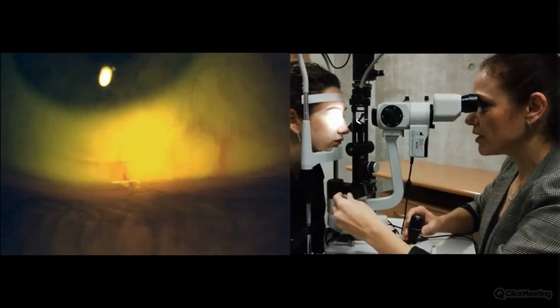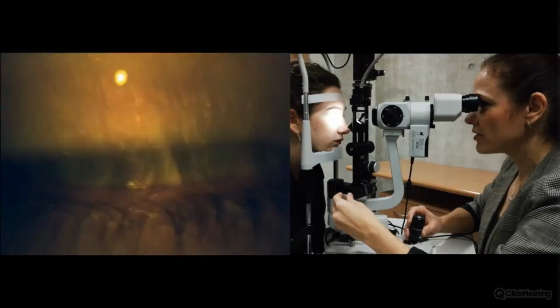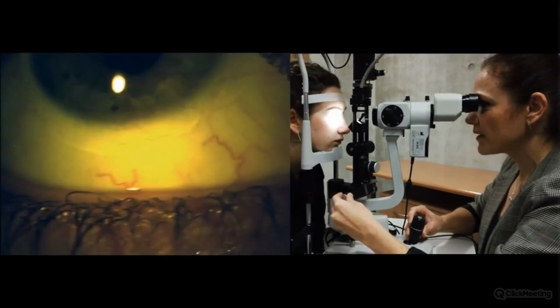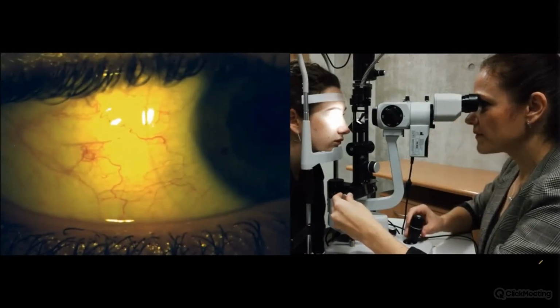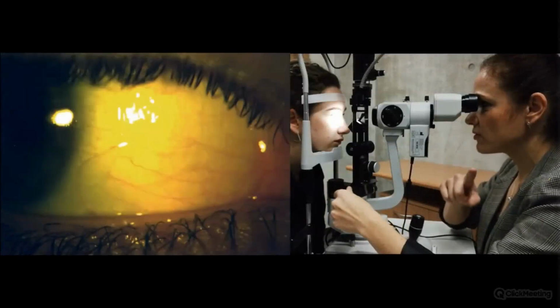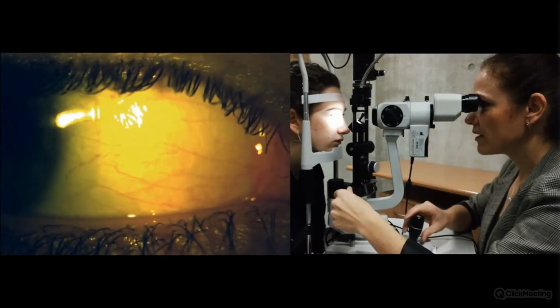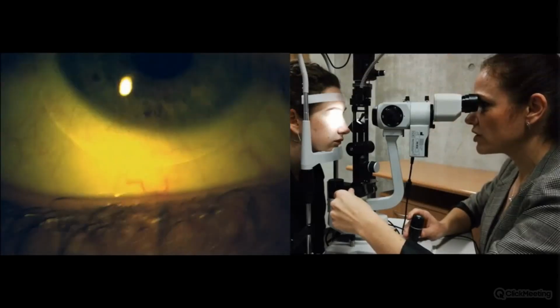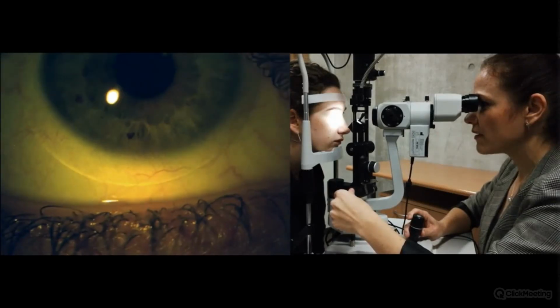For me, it's better to compare with the lower lid margin size. Then I see that this is 0.2, and it's quite good movement for this contact lens. Just now I ask the patient to fixate and look at this target. You see that the contact lens is a little bit slower than the movements of the eye. It's normal how the contact lens must move.